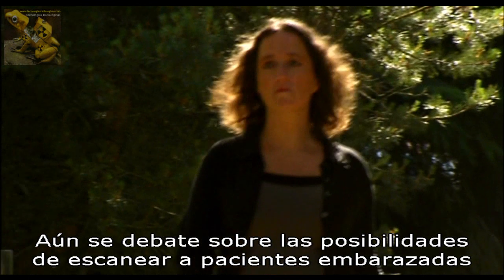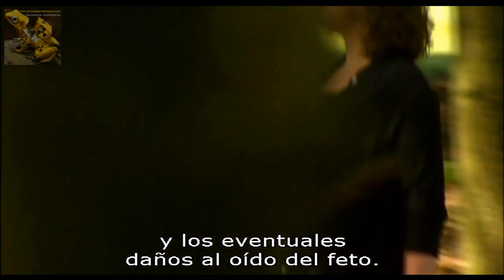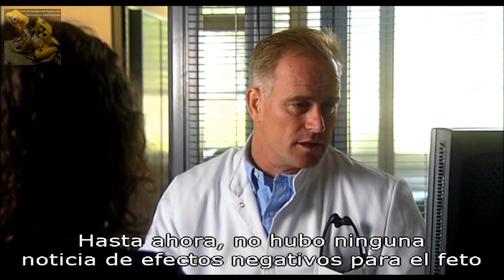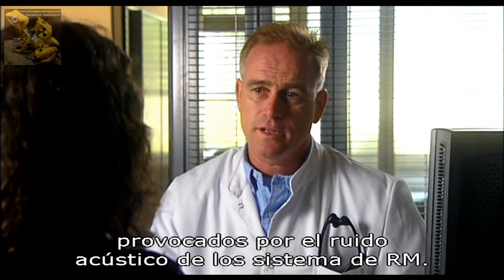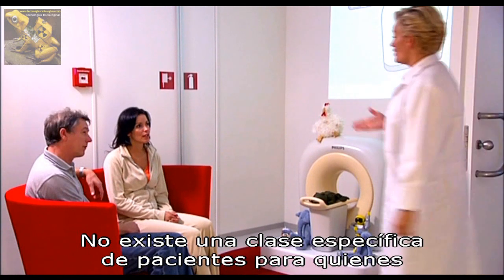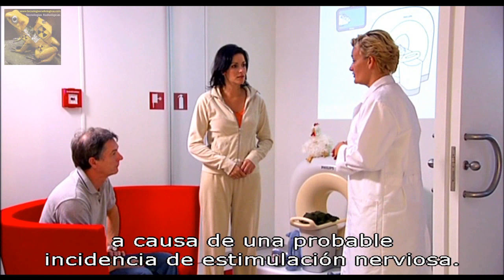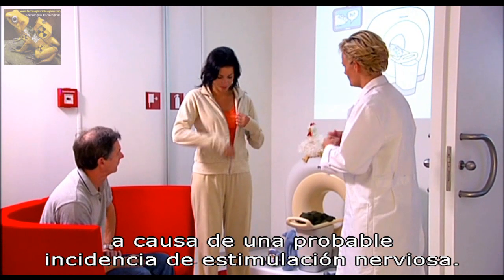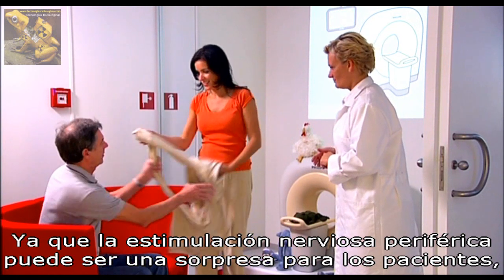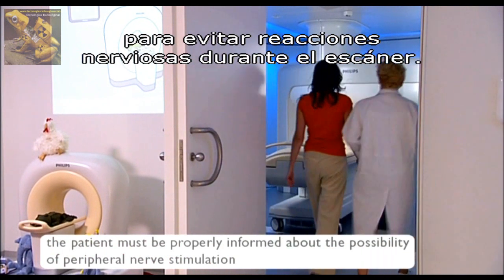There is still an ongoing debate about scanning pregnant patients and potential hearing damage for the fetus. So far, there have been no reports of negative effects of the acoustic noise of MR systems on the fetus. There is no specific class of patients for which an MR examination is contraindicated because of the possible occurrence of peripheral nerve stimulation. Because peripheral nerve stimulation could come as a surprise for the patient, patients should be properly informed of this possibility to avoid restlessness during scanning.